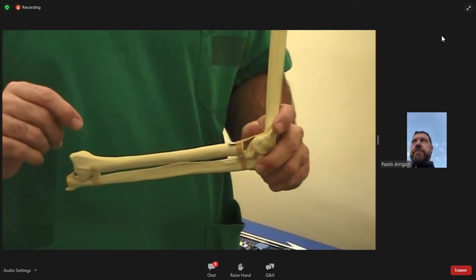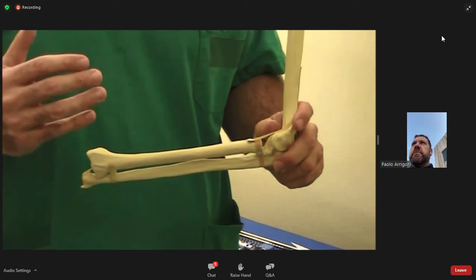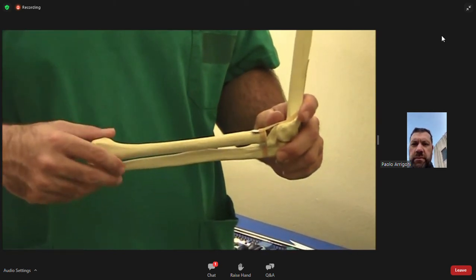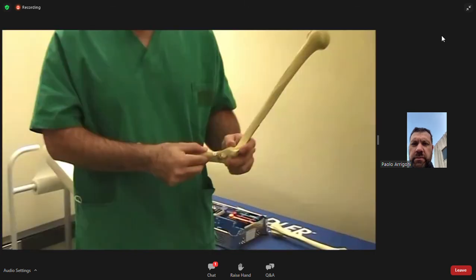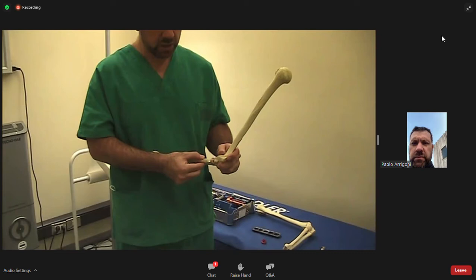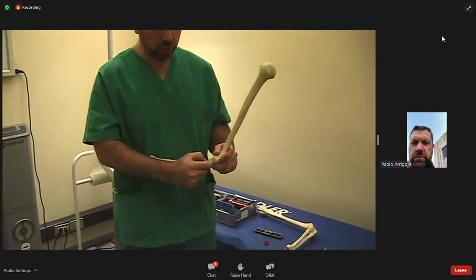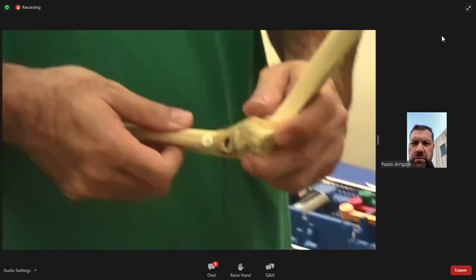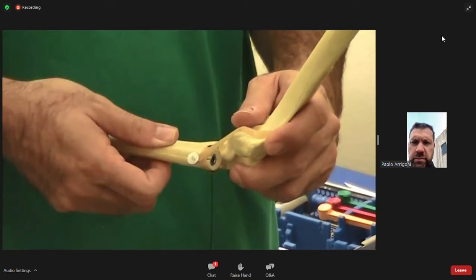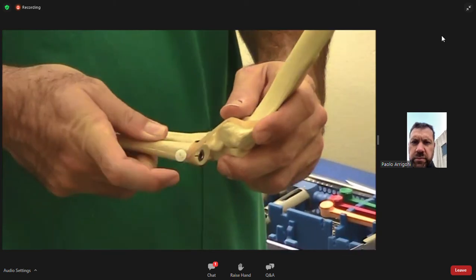C, the way in which you gain access to the radius is to extend, supinate, and dislocate the radius posterolaterally. In general, what I do is put a Hohmann retractor in between the 2 joints here, and another one here. So a Hohmann posterior and a Hohmann in between the joints, so that my radial head, my radius, goes posterior and lateral to obtain space, and I can work with my broaches almost straight away.